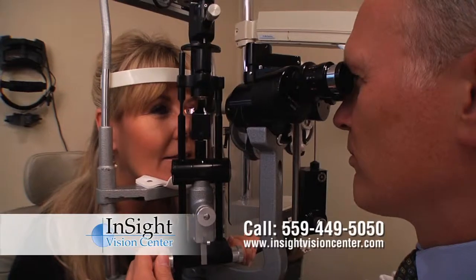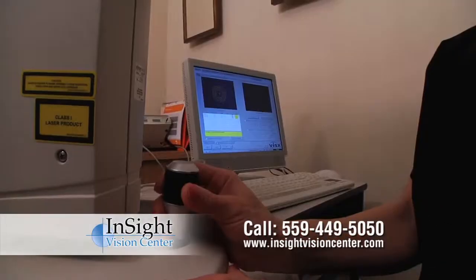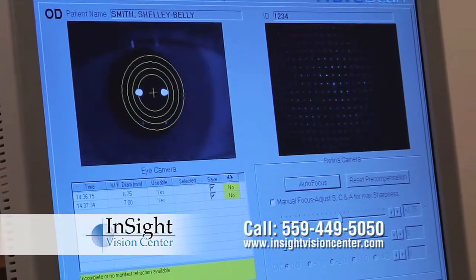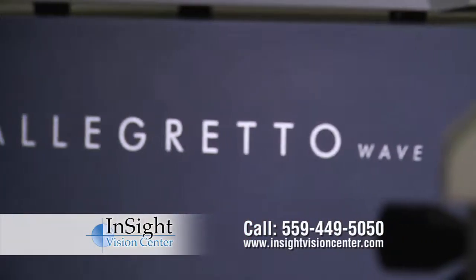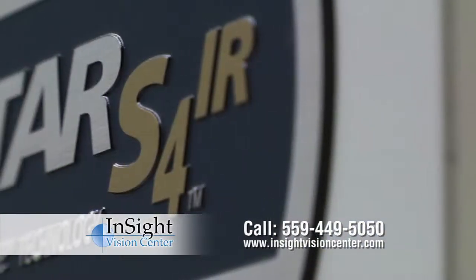Once we determine that you're a candidate, then we need to do some detailed preoperative testing to map the specific shape and size of your eye. That testing usually takes about an hour here in the office. Once we have all that information, we can create a custom treatment plan for you and transmit that information to our laser. We then need to schedule a day for you to have the laser surgery.